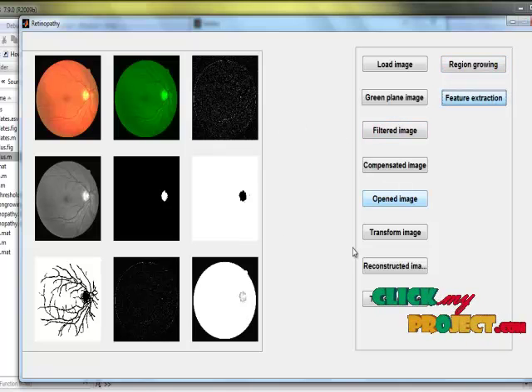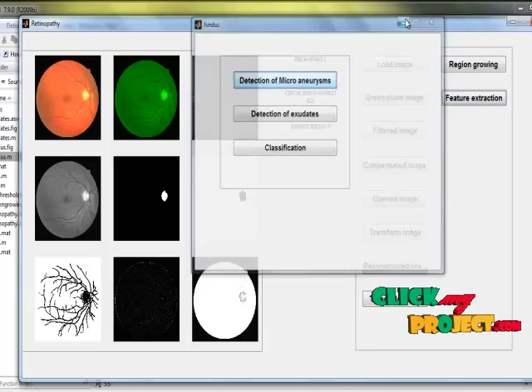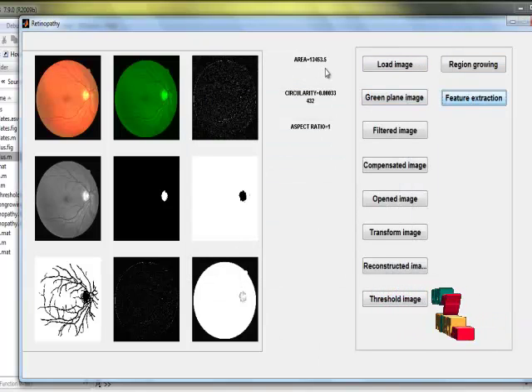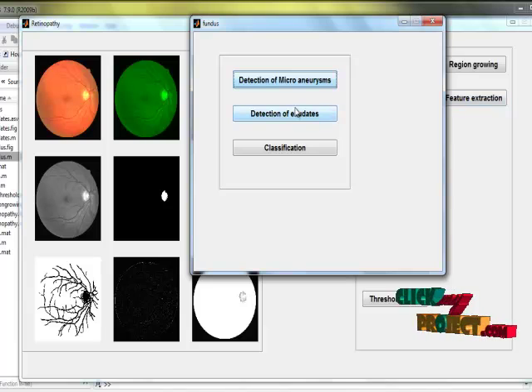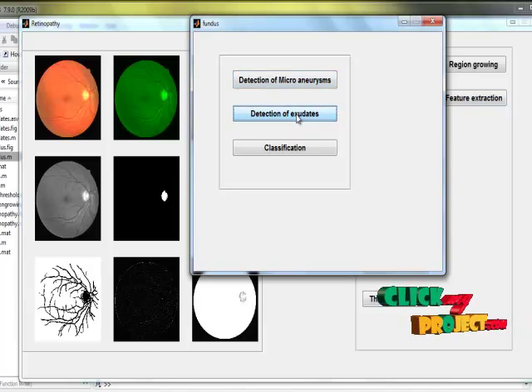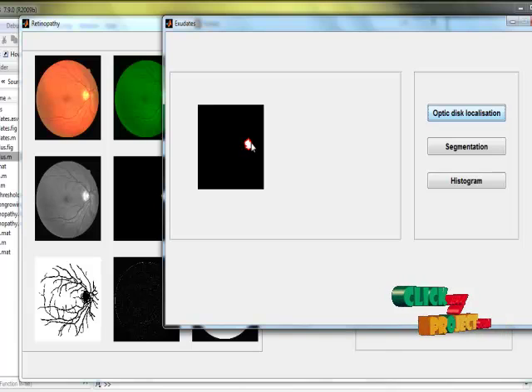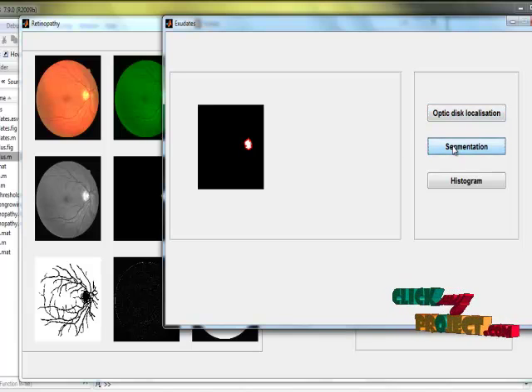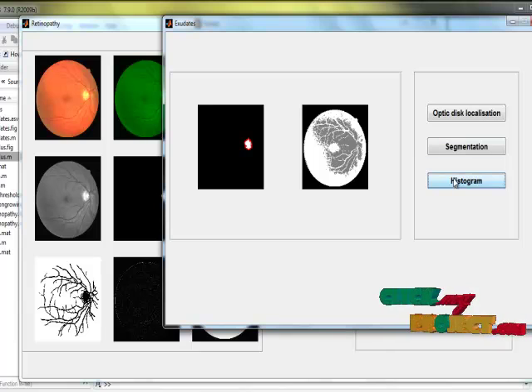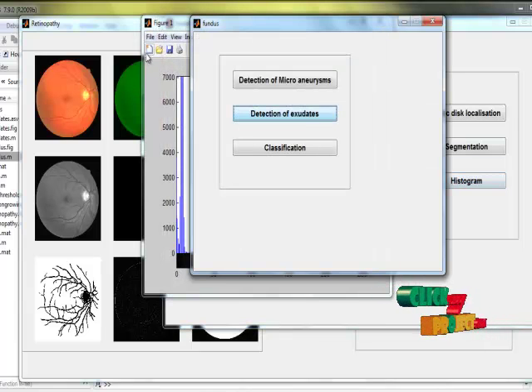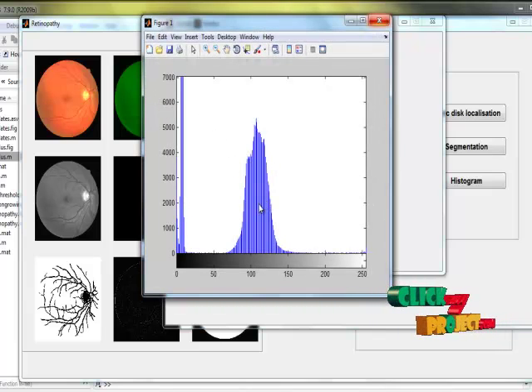Then feature extraction — in feature extraction we are calculating area, circularity, and aspect ratio. Then detection of exudates: here we are locating the optic disc. Then the image is segmented. This is the histogram graph for this process.